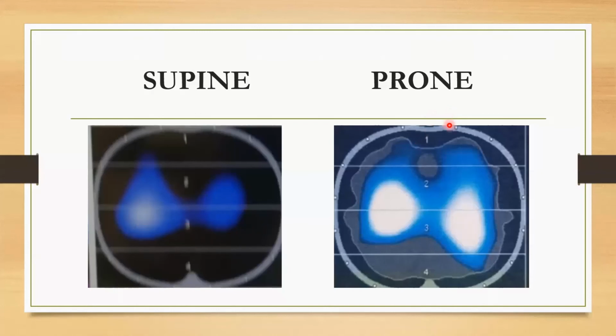Again, don't look at the template. I put this on backwards, the belt. So this is actually what the lung looks like. The chest would be here, the spine would be here. This would be the right side and the left side. There's a little bit here of lack of ventilation, perhaps because of the pressure of the patient lying on their chest. This was an opening.